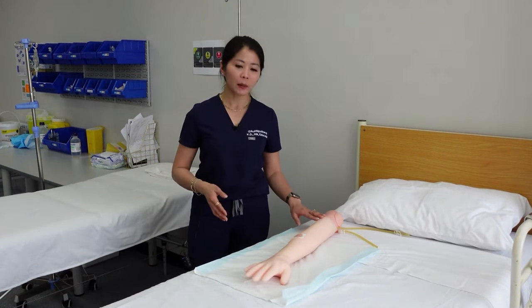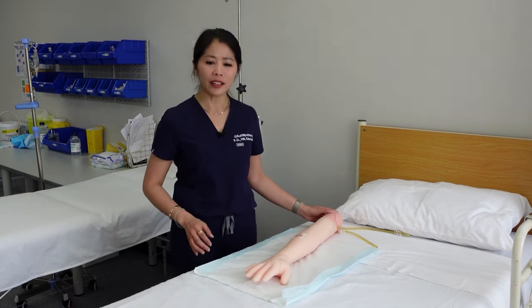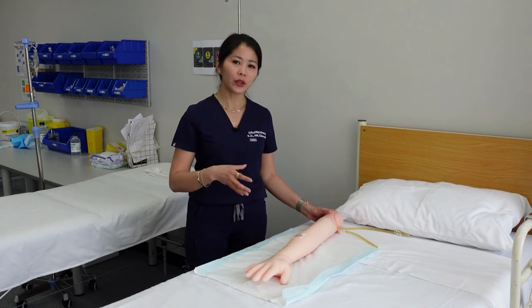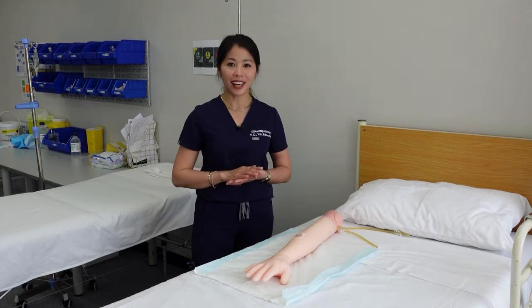Here we have a patient positioned well and comfortable for me to do the dressing. Another thing to consider is asking the patient if they have any pain, so when you do the dressing the patient is comfortable. The patient has been consented and well informed about the task.